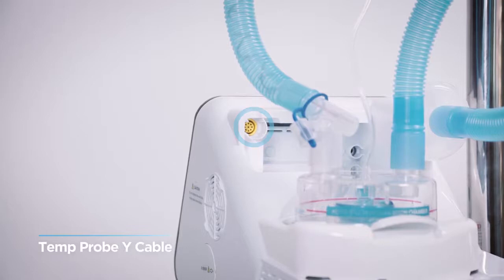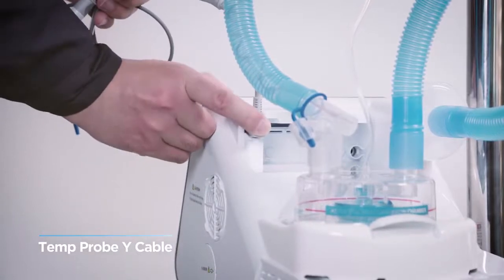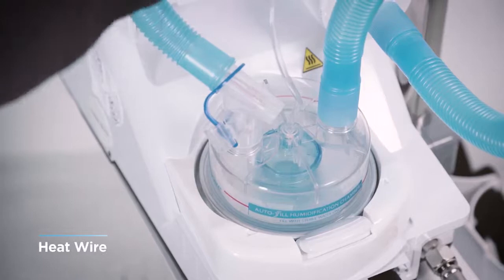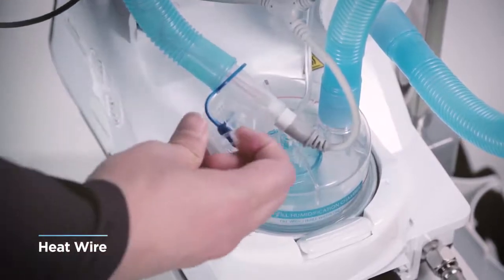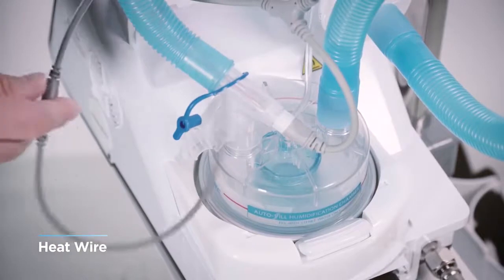If the Y cable is stored with the connection part bent, contact failure may occur, so it is recommended that the connection part be stored without bending. The heat wire should be matched with the female adapter at the end of the circuit and then tightened. For the temperature probe cable, open the cap of the temperature probe hole of the circuit and tighten.